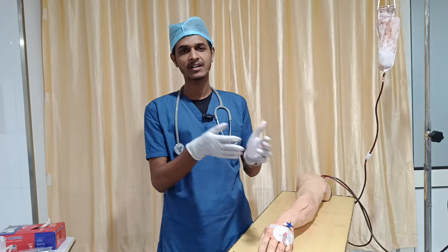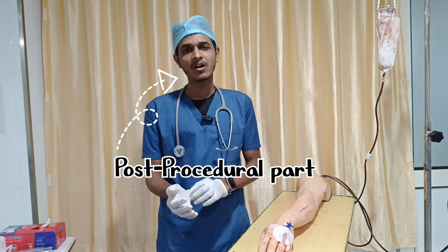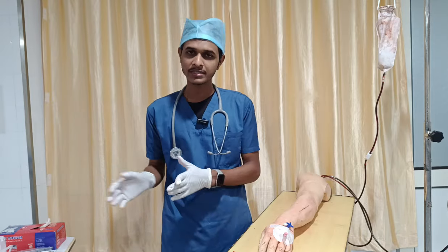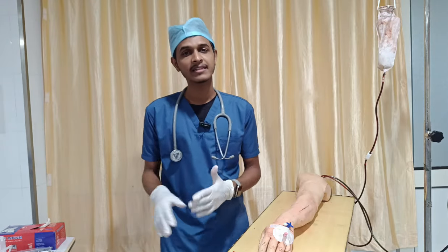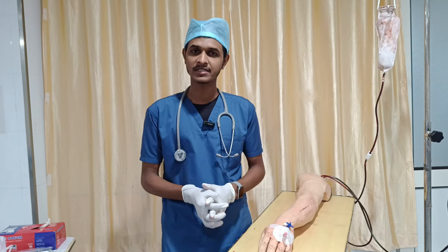We covered the pre-procedural and procedural parts. In the post-procedural part, you have to remove all your personal protective equipment. Before that, discard all the things in the correct waste segregation, and then thank the patient. Don't forget to make the documentation. Those are the things that come under the post-procedural part.